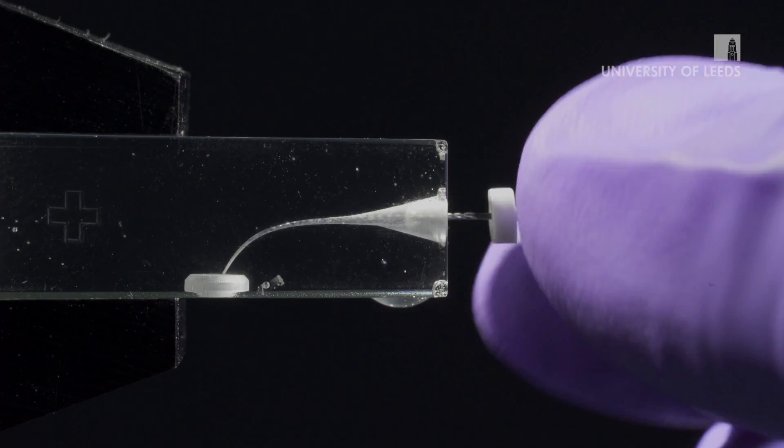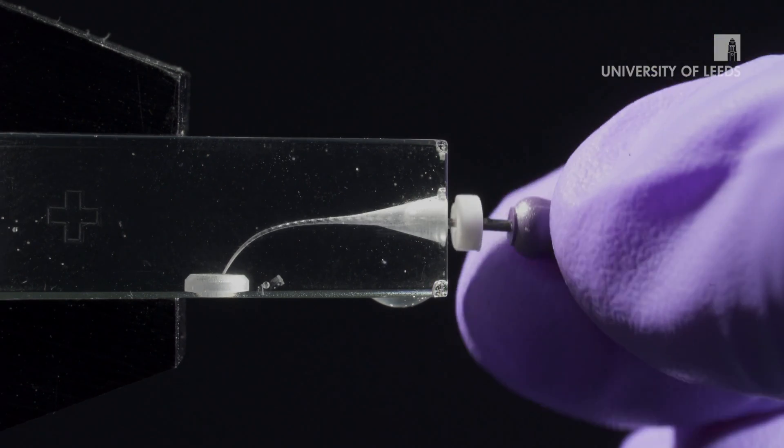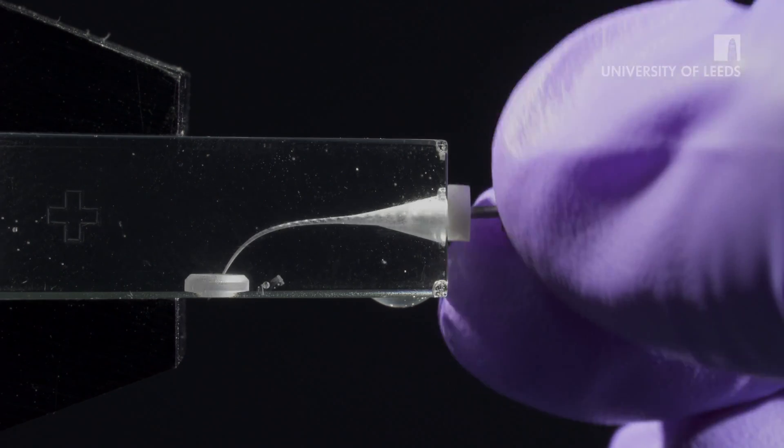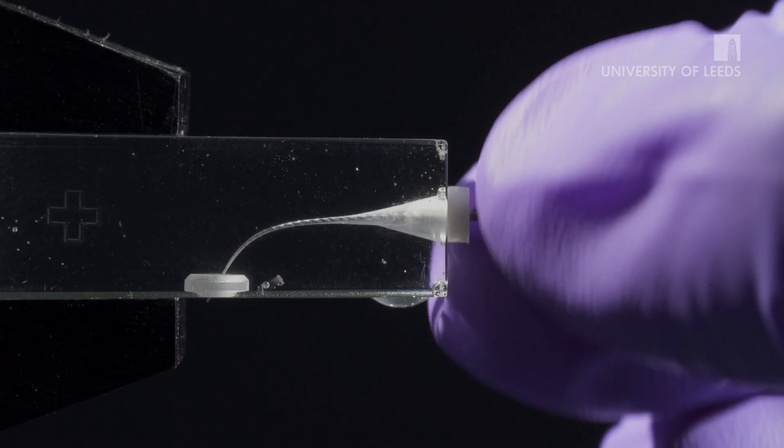If the coronal portion has been prepared correctly, the size 10 file should now easily go to length. In a clinical situation, it will be at this point that an apex locator will be used to establish the working length.